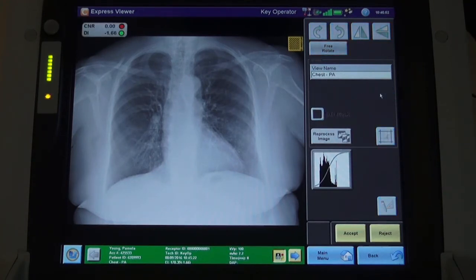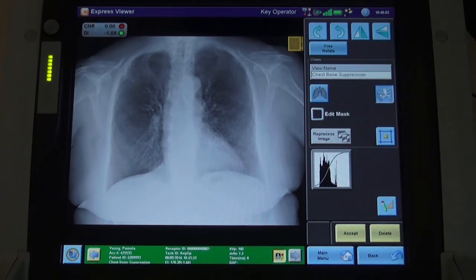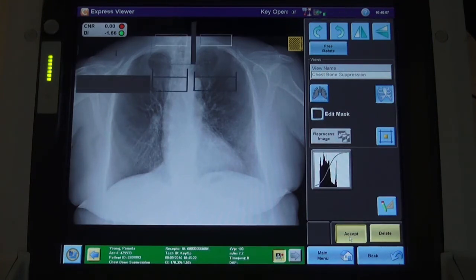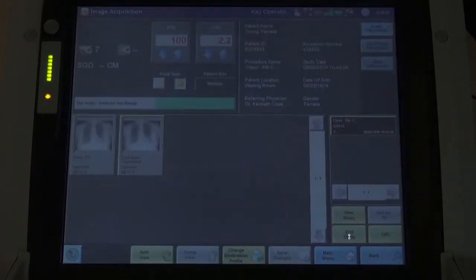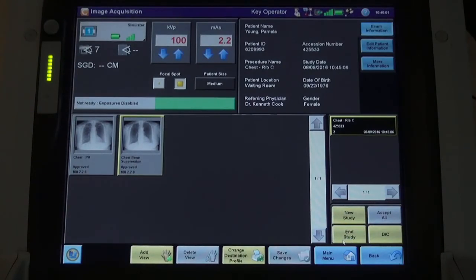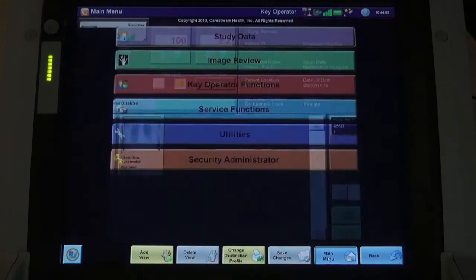Once they are satisfied with the two images, they select the Accept button and the images are queued to send to PAX. The radiographer can now navigate back to the main menu and prepare for the next patient.